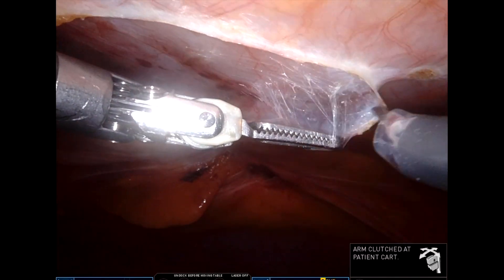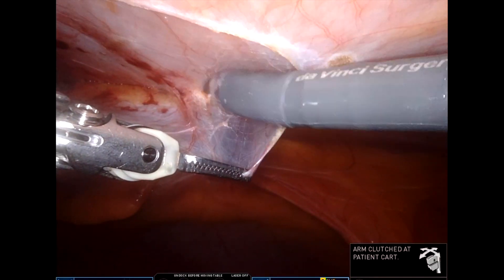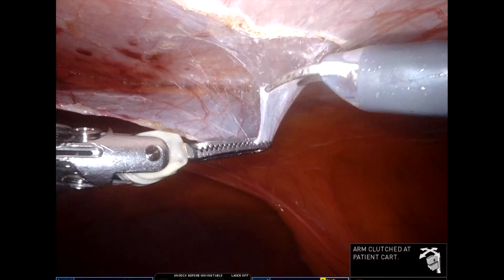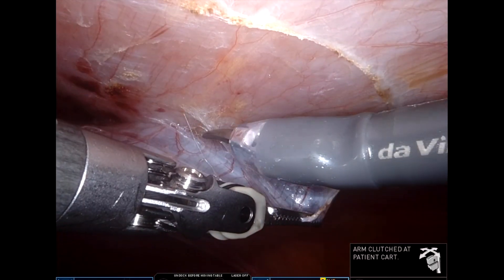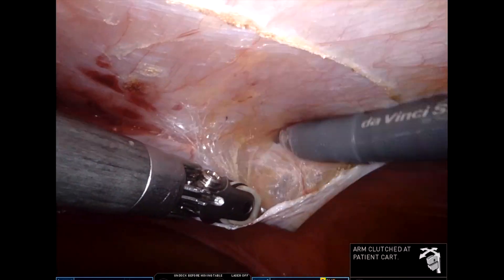I'm using my left hand here to create some space into the pre-peritoneal space first, and then using my scissor to incise it. It can be very well appreciated here that the peritoneum is super thin, and I'm using my left hand instrument to grasp it and then divide or push it.